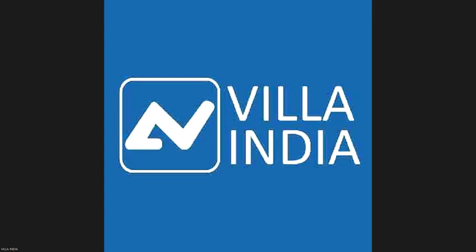We are delighted to have you join us today for an insightful webinar titled Implementation of NNT Software in Endodontics Diagnosis. This session is hosted by Villa India in collaboration with Neotom, leaders in cone beam 3D imaging. Today we have the privilege of learning from Dr. Apurva Gupta, an esteemed expert in oral medicine and radiology.